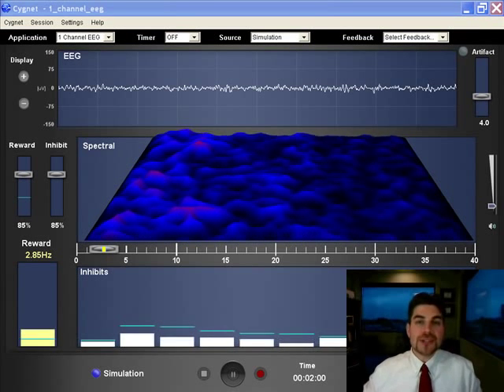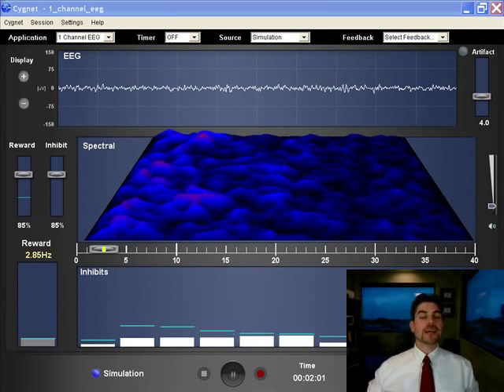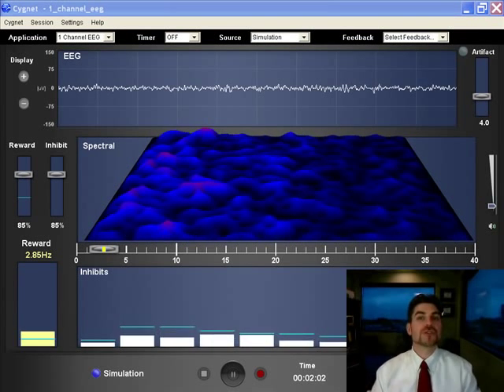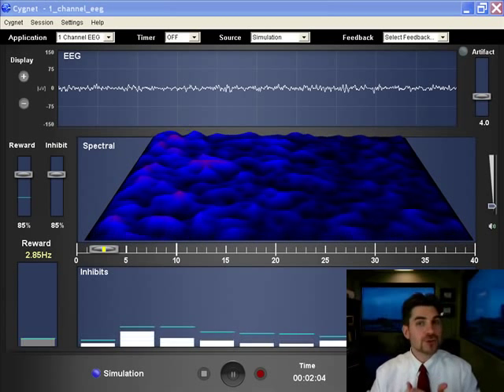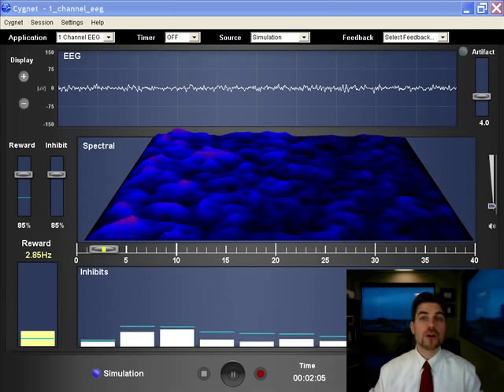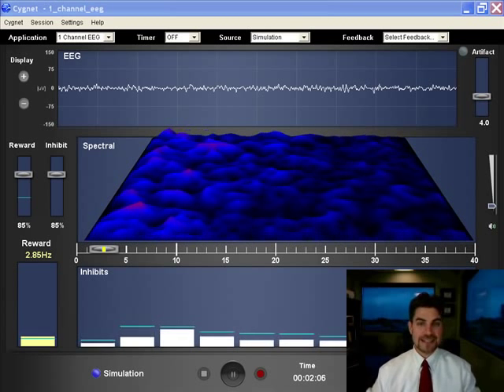Hi, my name is Kurt Othmer from EEG Info and I wanted to take just a moment to show you some of the features in our new software platform called Cygnet.